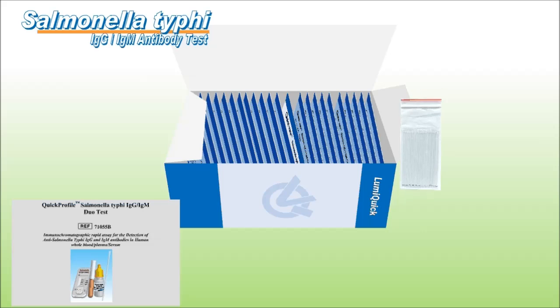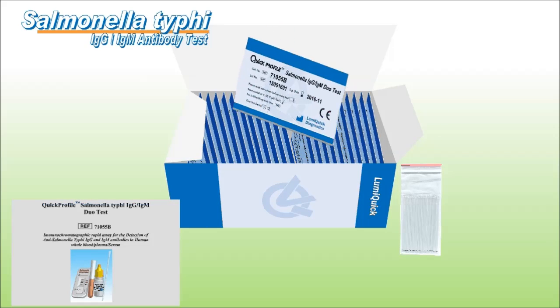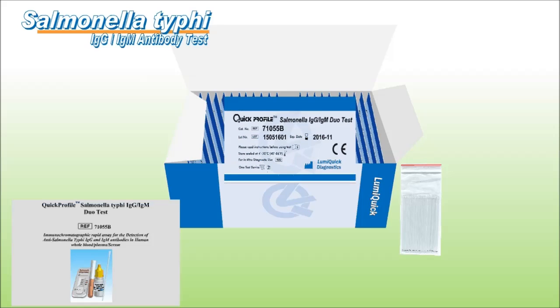This kit, provided by LumiQuick Diagnostics, contains 1 sample buffer bottle, 25 test devices, and 25 micropipettes.